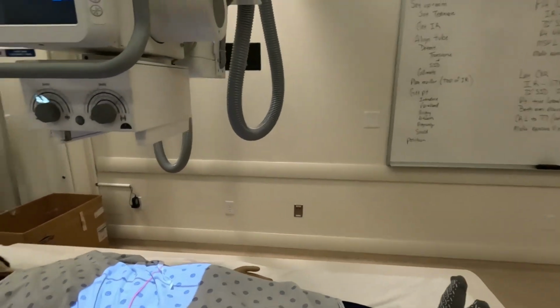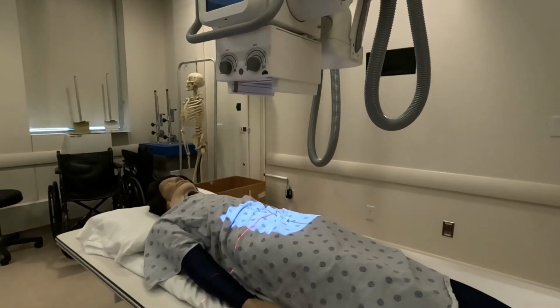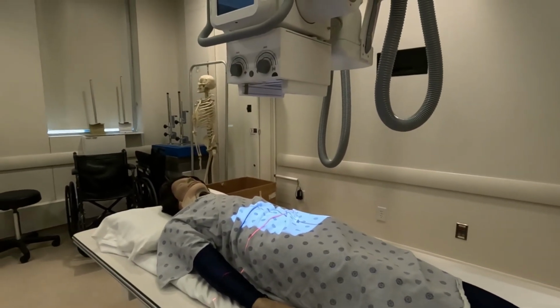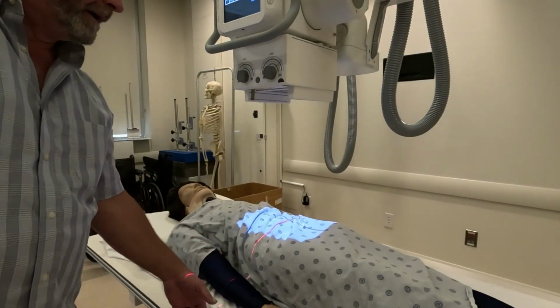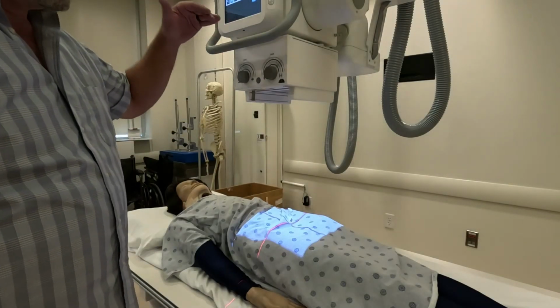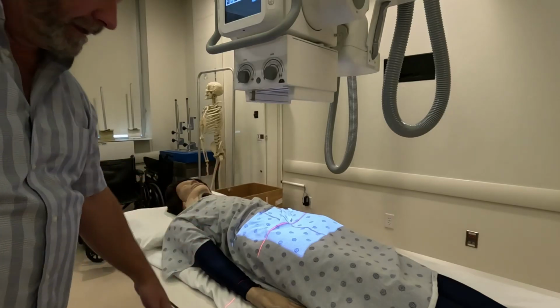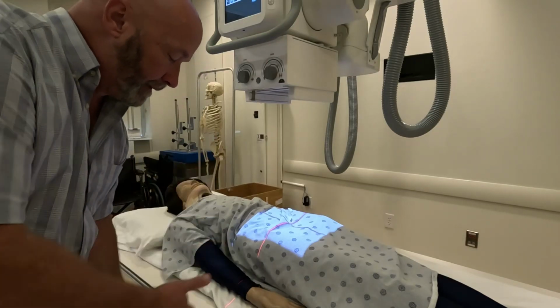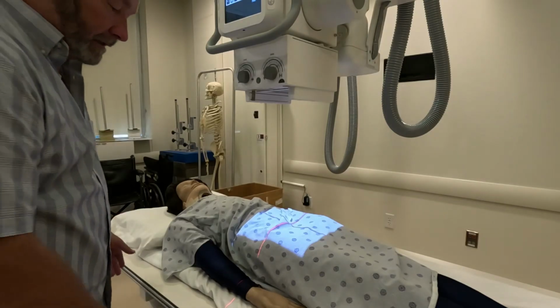So if we need to adjust the patient, again, what you don't want to do is move your X-ray tube, because if you move your X-ray tube, you're going to have to move your image receptor as well. Once I have my X-ray tube aligned to my table, locked in, and I have my image receptor aligned to my X-ray beam, then I can just move the patient throughout the radiation field.